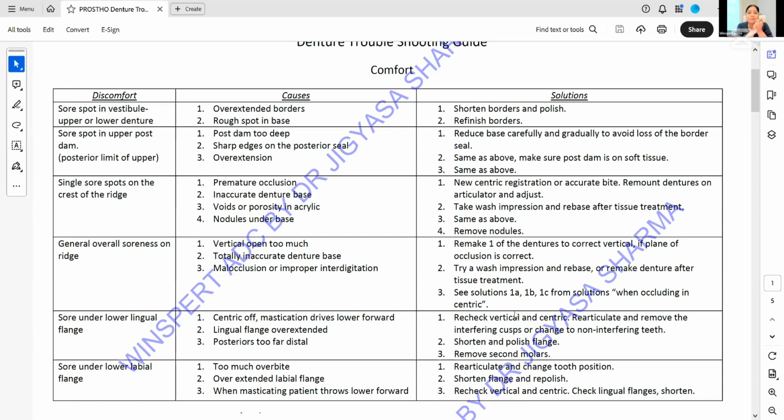When you find premature occlusions, you correct them: mount the dentures on your mounted casts and articulators, remove the dentures, adjust them on the articulators, and then do the selective grinding there. Is that clear for everyone? The ideal management in your patients and ideal answers in the exam should be the same, right?